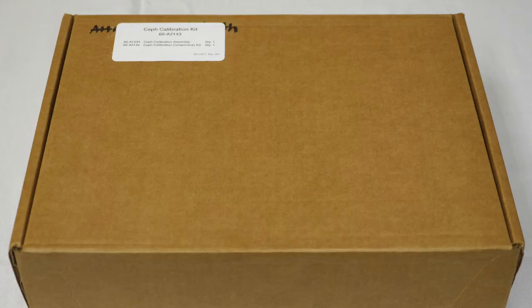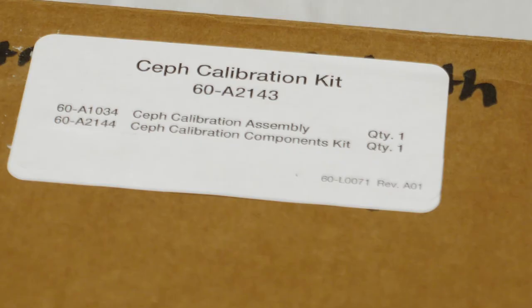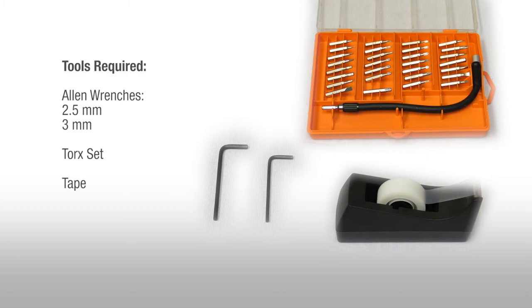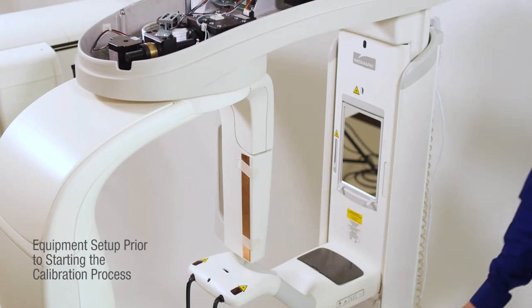To begin, locate the Ceph Calibration Kit and be sure all the items shown are included. Also gather the USB drive with the calibration files for the sensor and the image phantom. Next, gather the tools required: Allen wrench sizes 2.5mm and 3mm, a Torx set, and tape.